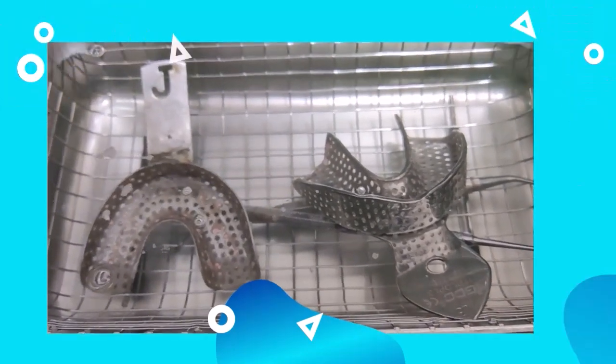You can see the particles being removed. Now we will see the results of each instrument individually. It is clearly visible that all the dental instruments can be cleaned by this ultrasonic cleaner. You can clearly see the particles removed from these instruments, which have been cleaned by the ultrasonic cleaner.